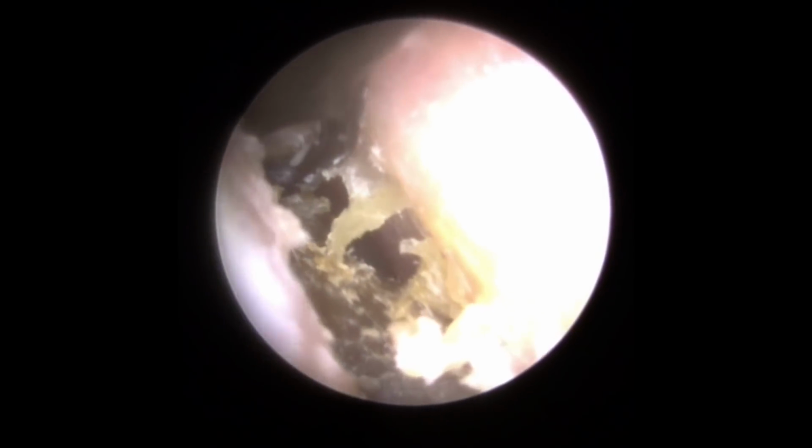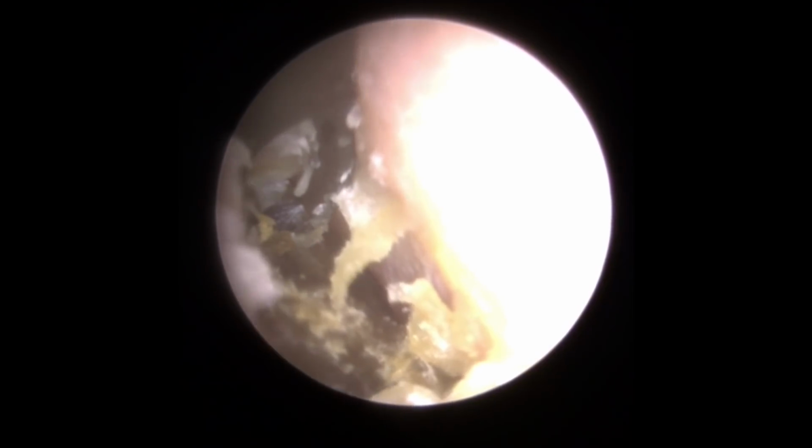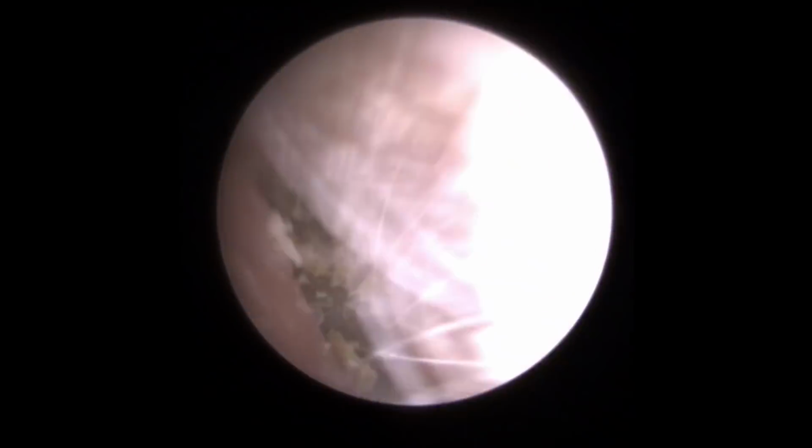The suction is not strong enough to hold on to it, and because it's hard with a flat surface, it's not going to get a good grip. The Jobson can't really get behind the wax to pull it forward, so I'm just trying to chip and make a ledge if I can to get a hold of with the Jobson horn. And the St. Bart's hook can't get far enough behind the wax to bring it forward, and that's the only effective way of removing with the St. Bart's, unfortunately. So you can see we're trying every tool in sequence here.